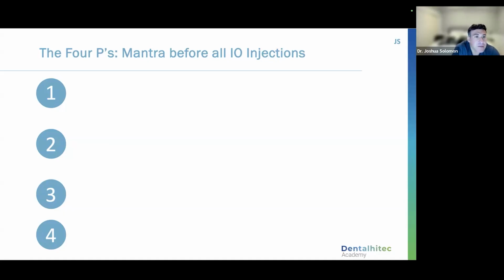I will not guarantee you that you can pop through with manual bone penetration on a teenager or an adult. This weekend when we did training, I did some myself, and some I helped out, and I found that most adults, if they have thicker plates, you're not going to pop through. So these devices ideally are designed for primary and mixed dentition.